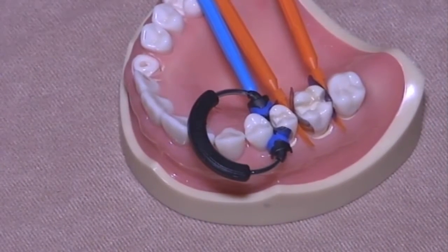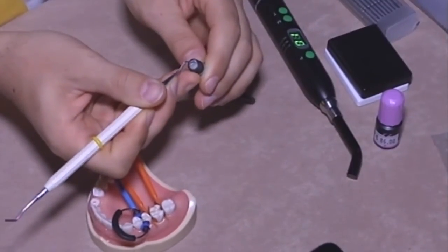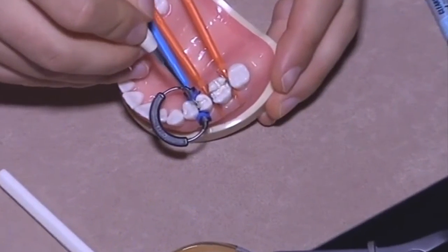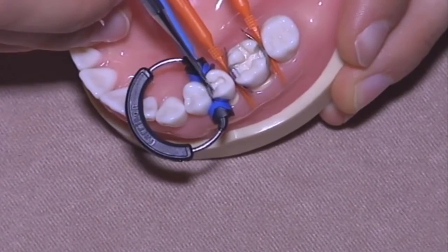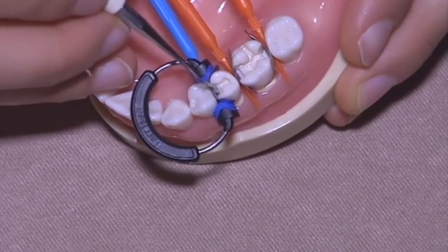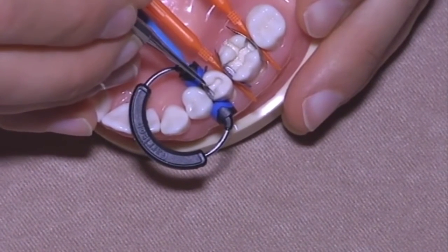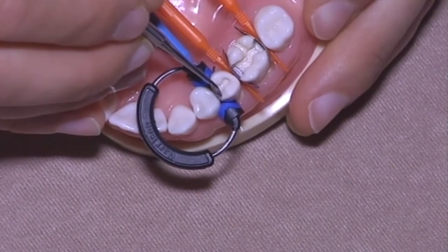And then with a single layer of composite, you can place it and start pushing the composite towards the matrix very slowly in order to create the interproximal wall. First, you have to take care to close the bottom of the cavity.